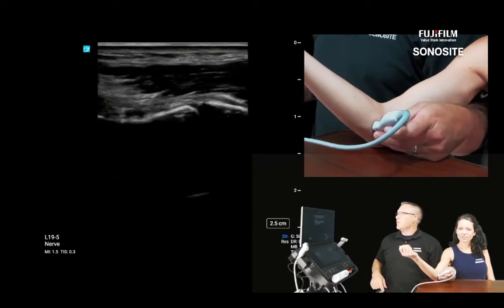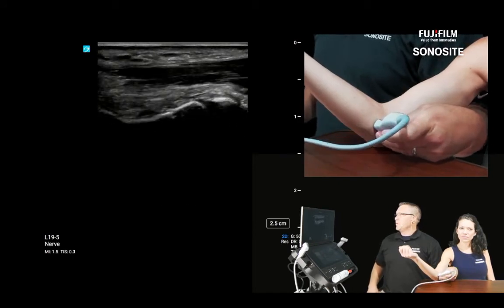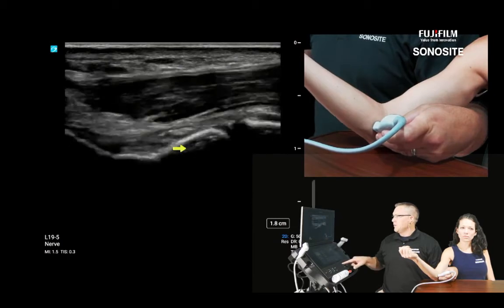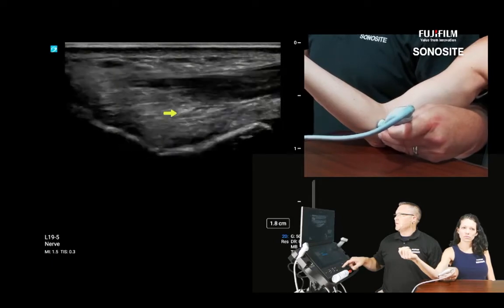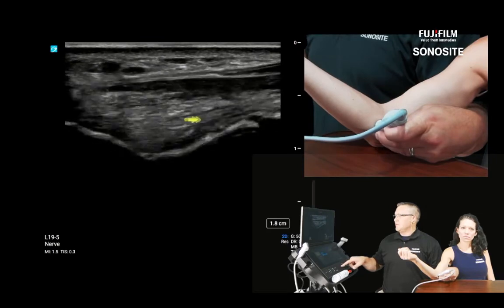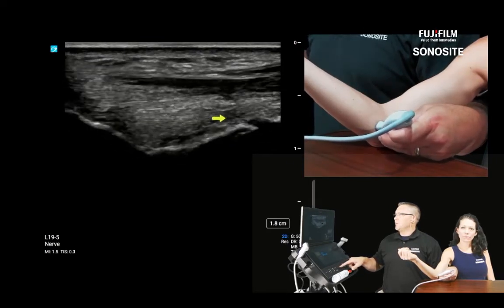Now we're going to see something that looks almost like a tendon. It's so big when we look at things with the L19. I'm going to bring our depth up more shallow, bring the arrow back up. And here I can see these fibers with a lot more confidence, as Bill said. Even with the 15 megahertz probe, which was beautiful, I'm actually seeing fibers that we don't normally get to count. We see the shape of the UCL typically.